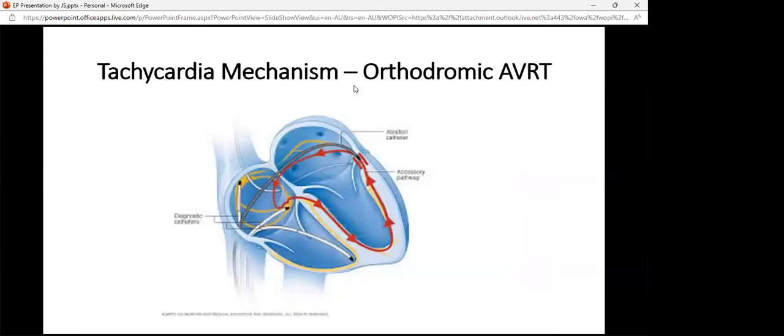And from that, we have our diagnosis of an orthodromic AVRT, meaning that this patient has conduction from the atrium through the node, down the His-Purkinje system, and then back up a pathway located here in our left lateral of the left atrium. And you can see this catheter here is a representation of our coronary sinus catheter. And we said before that CS distal, this 1-2 catheter here, was getting activated first. And this is the mechanism of an orthodromic AVRT. And this is what this patient had.